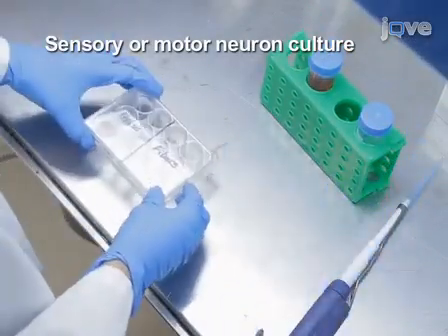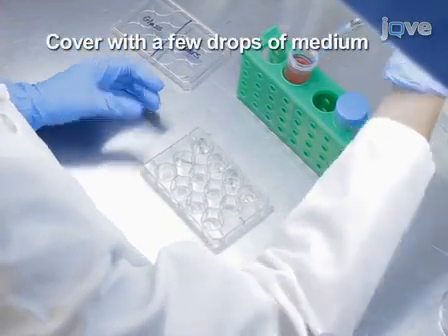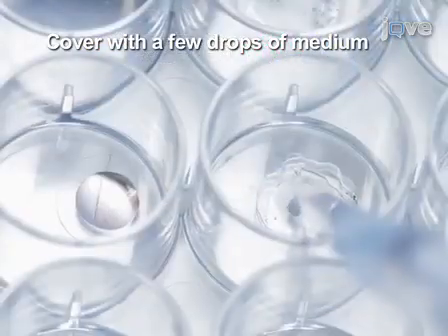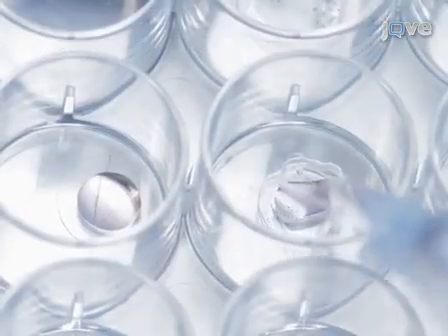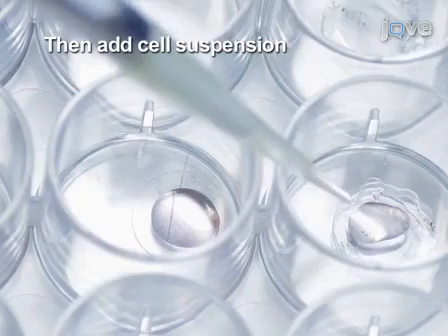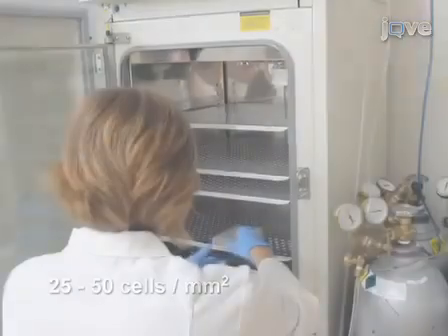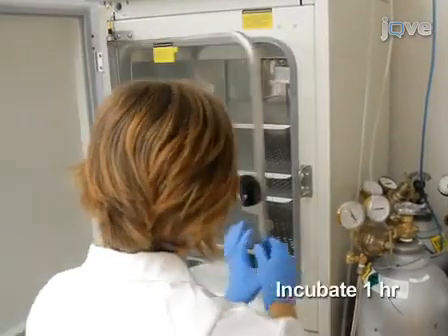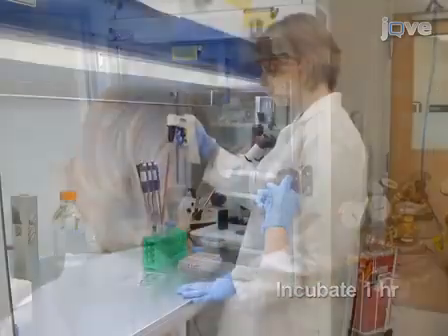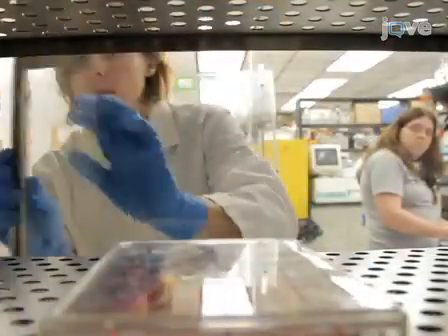To culture sensory or motor neurons, begin by covering the protein-coated electrospun fiber substrates with a few drops of medium. Then, add an appropriate volume of cell suspension. Dissociated cells should be plated at a low density. Allow the cells to adhere for at least 1 hour in the incubator before flooding the wells with medium and returning them to the incubator.